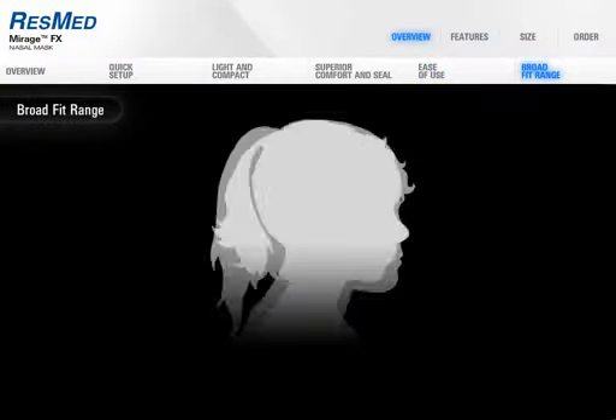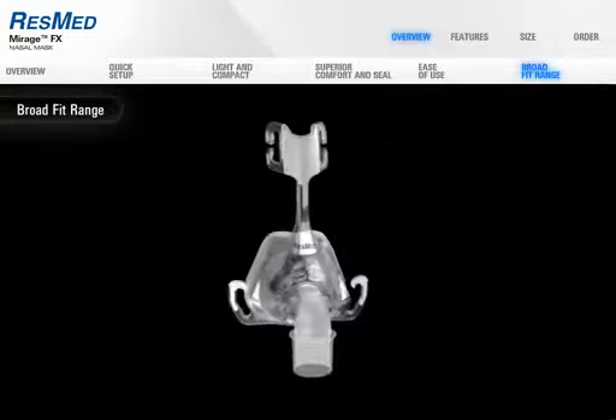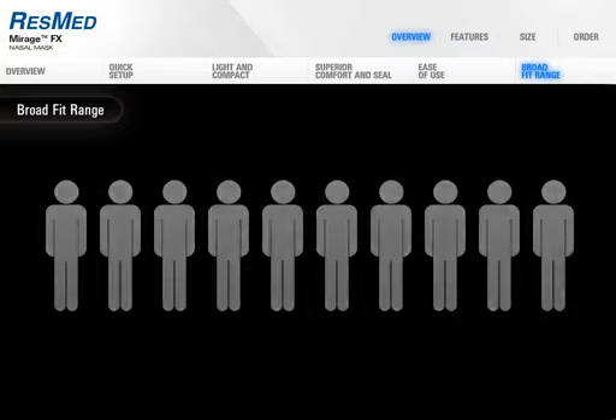Using the thousands of anthropometric facial scans in our extensive database, Mirage FX was designed to cater for a broad range of therapy users. You can fit a remarkable 9 out of 10 people with the one standard size. And to ensure that everyone can achieve maximum fit and comfort, Mirage FX Wide caters for those with wider nasal features.